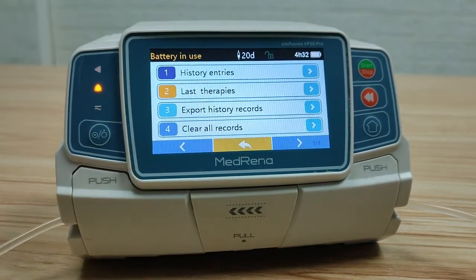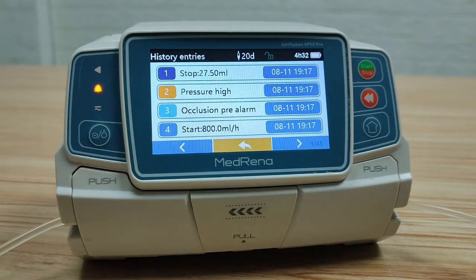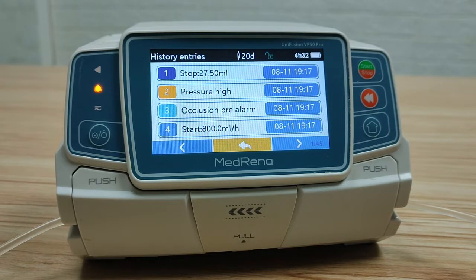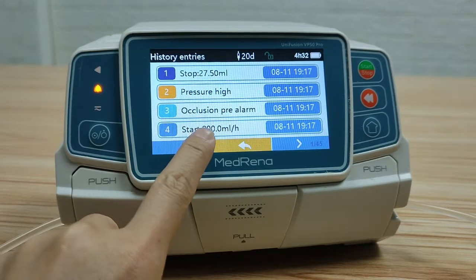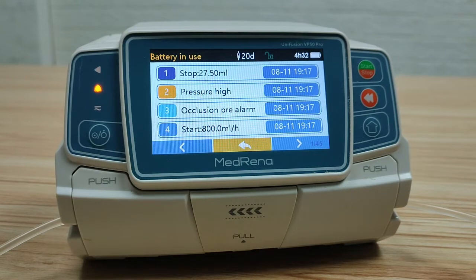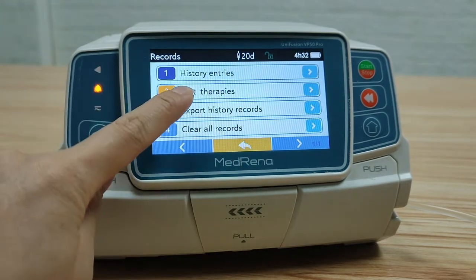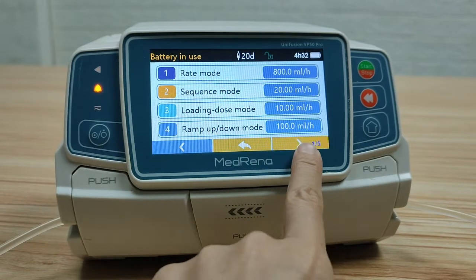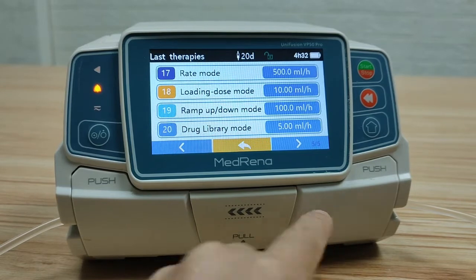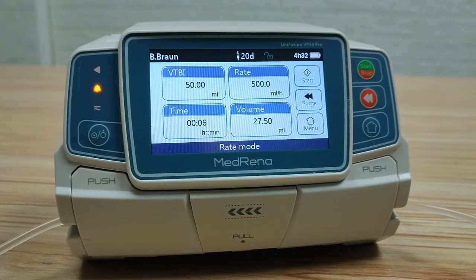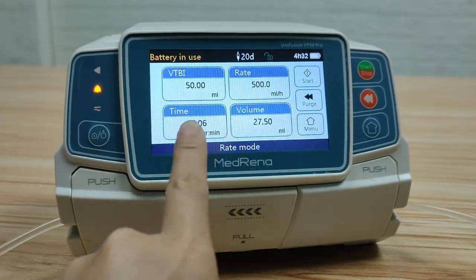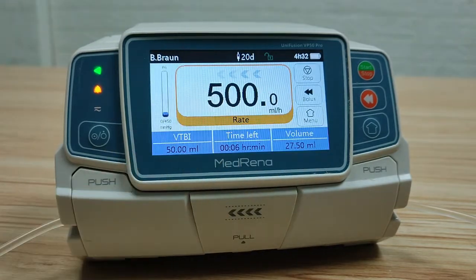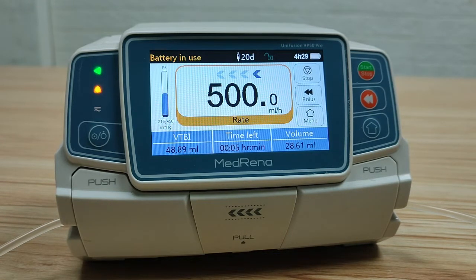Records: first, history entries. The pump can store more than 5000 records of previous operation data, showing date, time, infusion parameters, and operation details. The data is first-in, first-out. Last therapies: the pump can store 20 records of last therapies sessions. Choose either one and it jumps to the infusion mode screen with all infusion parameters ready to start infusion. This can save time for the user if they just need to apply the same infusion as a previous infusion.